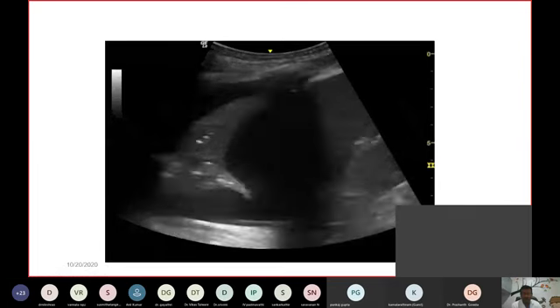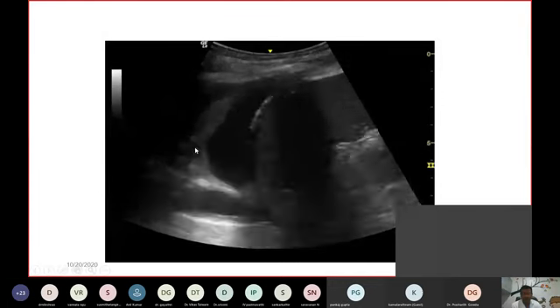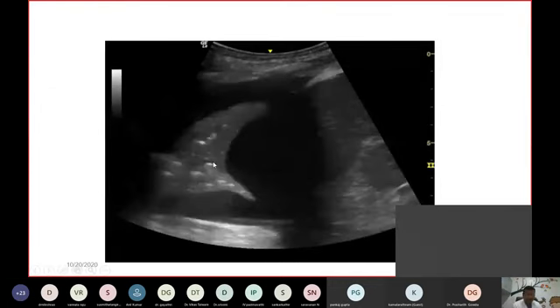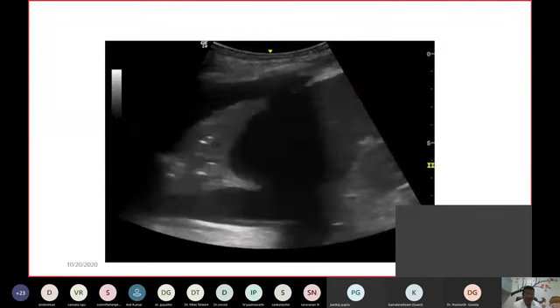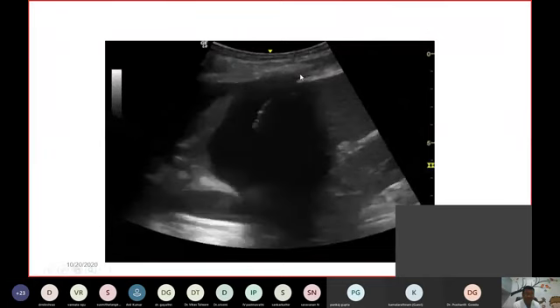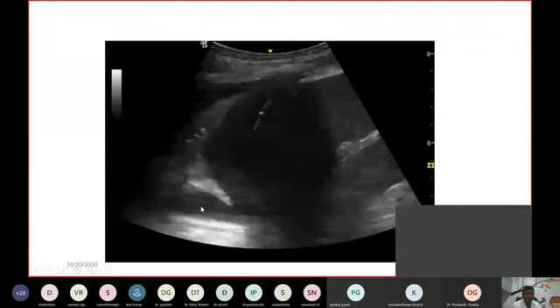And then you can see the bronchogram in the lung tissue, which is actually constant. It is a static air bronchogram. You can see there is no movement within. It is fixed. So this is a static air bronchogram, and you have clear-cut margins of the lung tissue.